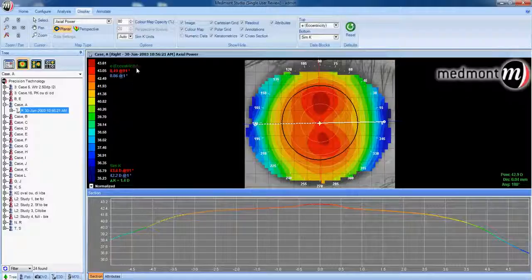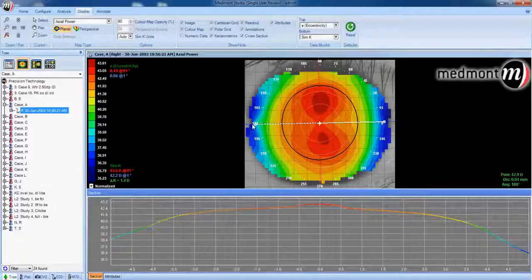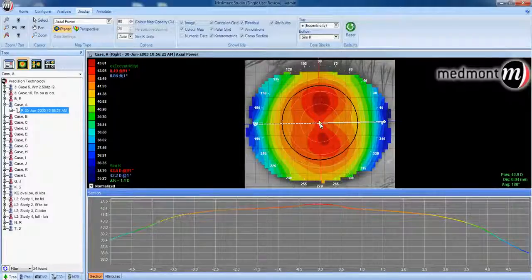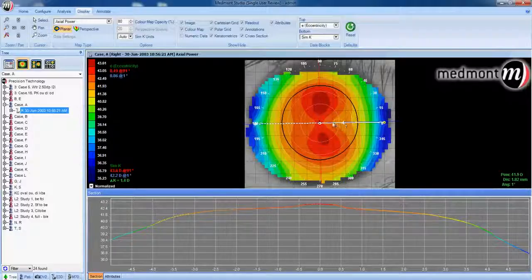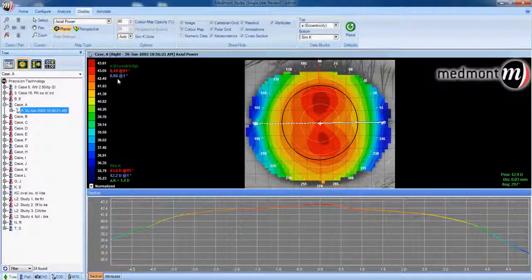Next, we could look at the eccentricity value. Eccentricity is a measure of the rate of corneal flattening of the eye — from the apex to the periphery, how high is that rate of change? The higher the eccentricity, the flatter the cornea becomes as you move toward the periphery. Taking the white axis line along the horizontal meridian, we observe the graph going from steepest curvature in the center to flattest curvature toward the periphery. 0.86 is the measured eccentricity.